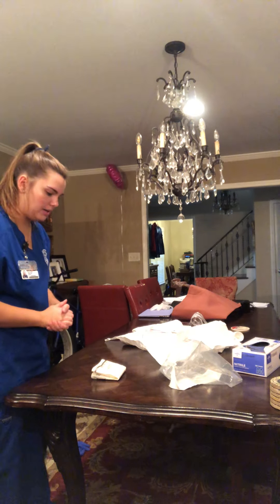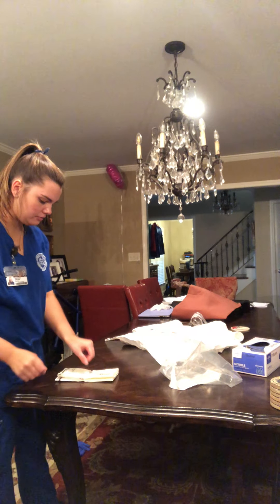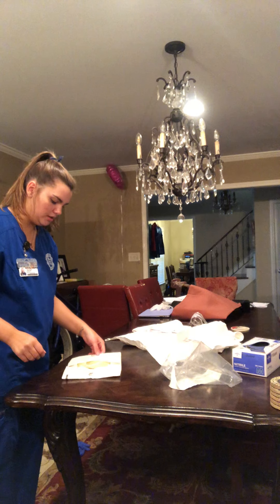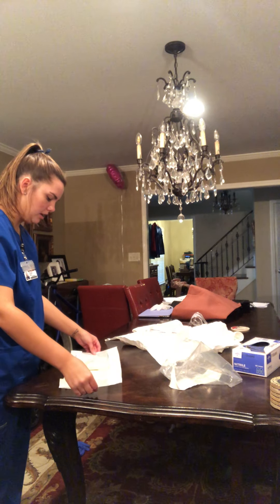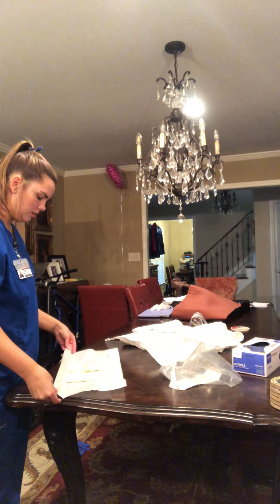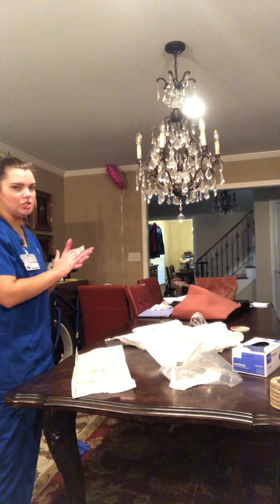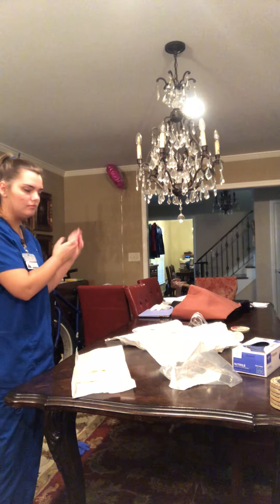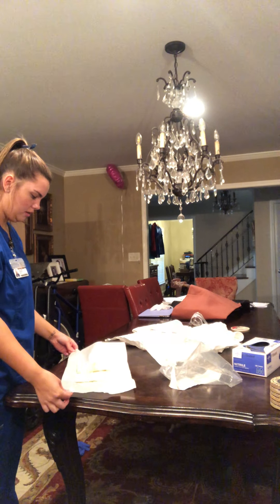Now I'm going to apply my sterile gloves. I'm going to remain on the one-inch border, which is technically contaminated. I'm just going to unfold this. Also, before I would even start this, I would do hand hygiene — just making that clear. Hand hygiene before I do this. So I'm going to fold this down.